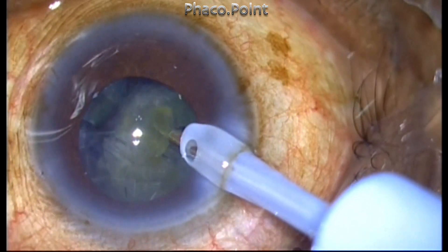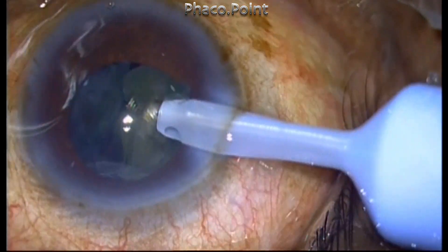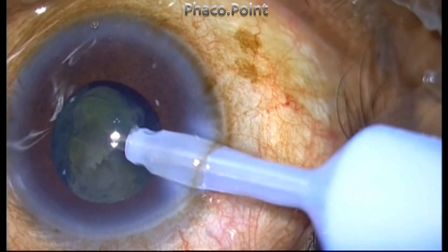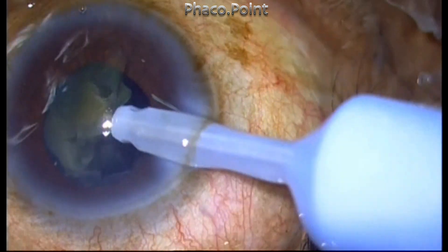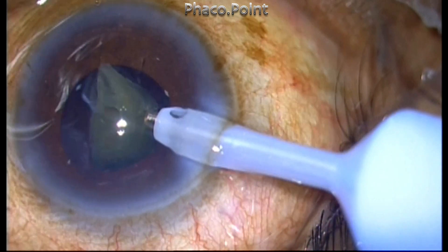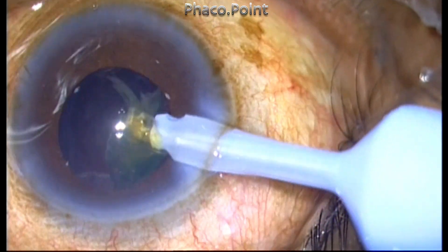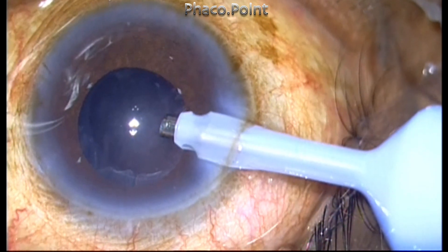For a sub-incisional fragment, I turn the bevel face down — this causes immediate occlusion of the nucleus fragment, and then you can bring it to the center. As you bring it to the center, the bevel is slowly turned upwards so it is made safe and doesn't damage the posterior capsule. This way the entire fragment is completely removed even without the use of a second instrument — it's a single-handed removal.